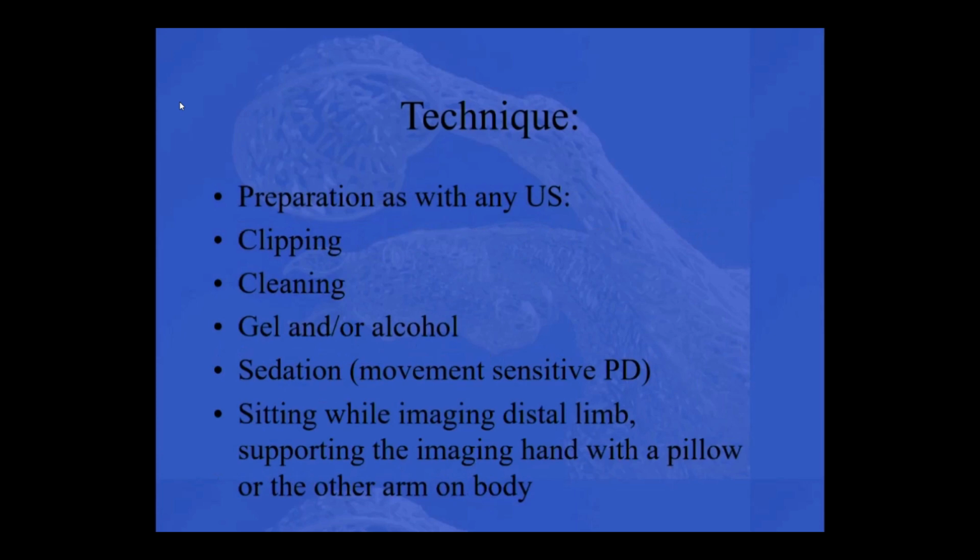Technique for the preparation is similar: clipping, cleaning, gel and or alcohol, depending on which structure you're looking at. If you use near field or far field, I use sedation a lot, especially with power Doppler, because motion quickly gives you your flash effect. So if the horse is really standing quiet, it's much easier.